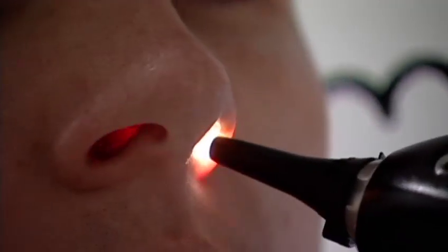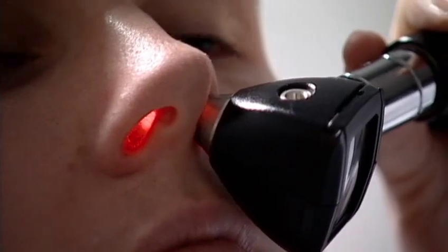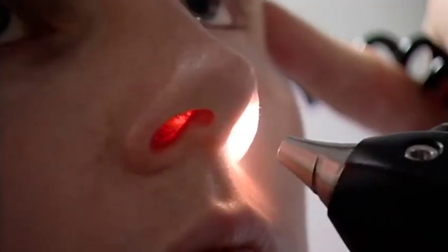So we'll just shine the light in the left side, and we pick up a nice red glow on the right side. Sometimes best to take the nasal speculum off and get a nice transmission of light into the right side of the nose. It's easier to see this when you do it yourself as opposed to in the photography here, but it's a very useful technique. Let's try it once again. Again, light in the left side, and you're examining the right side, and a nice transmission of light through to the right side of the nose. So that's transillumination of the nasal septum.